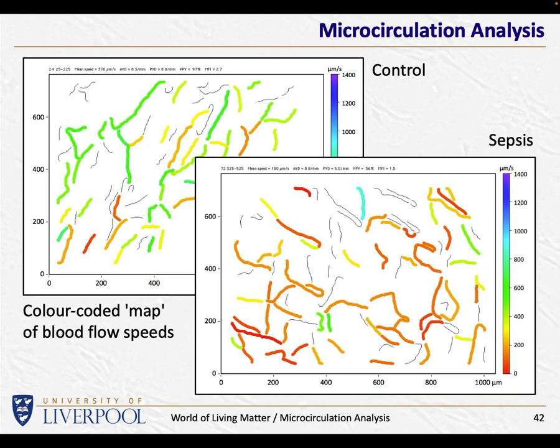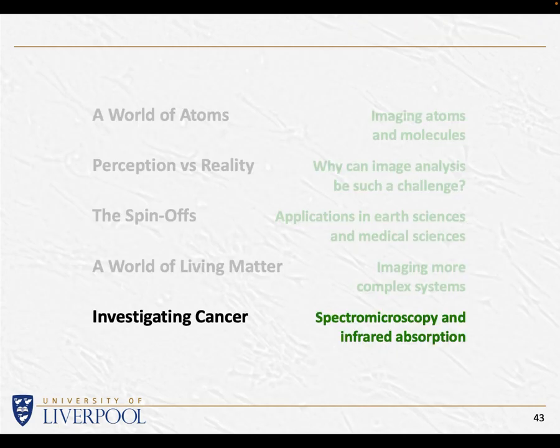And if it's poor blood flow under the tongue, that's an indication there's poor blood flow throughout the entire body. So that was the intention, to actually produce a software tool that could display on a screen a summary of what this patient's blood flow is, such that you don't have to go to a consultant and say, excuse me, can you spend half an hour looking at this video to tell me whether or not this patient needs more treatment or less treatment for their particular problem. So it was definitely with the cooperation of the NHS, but unfortunately no full clinical trials.